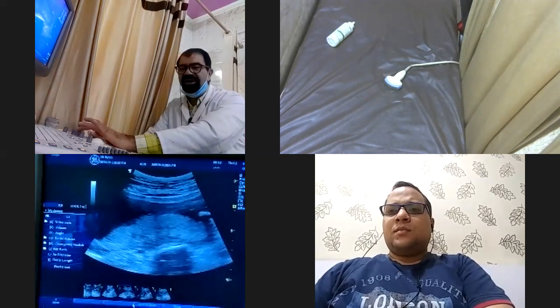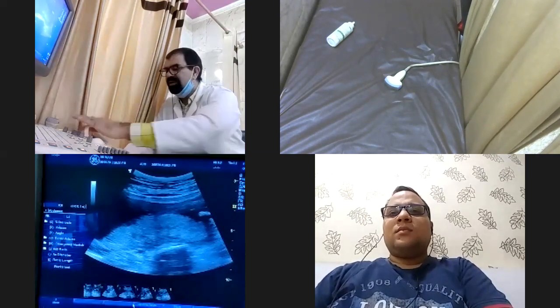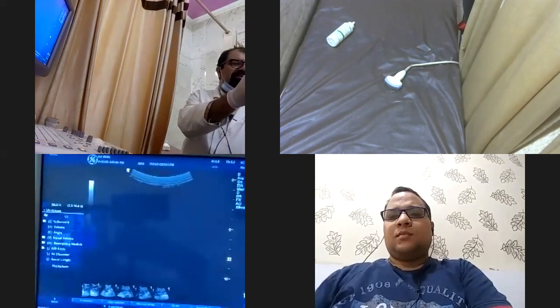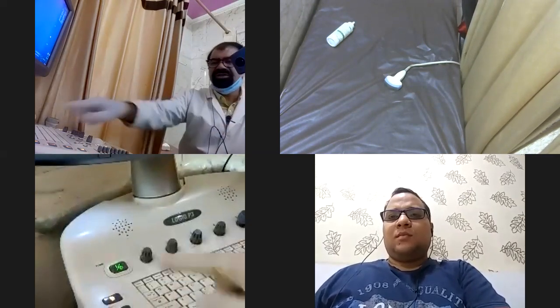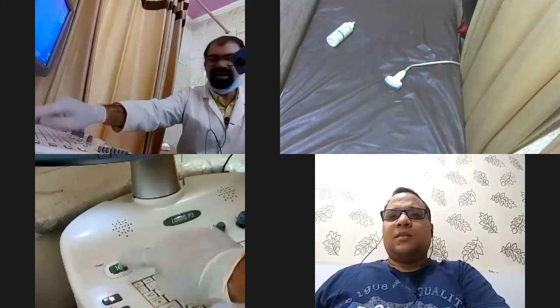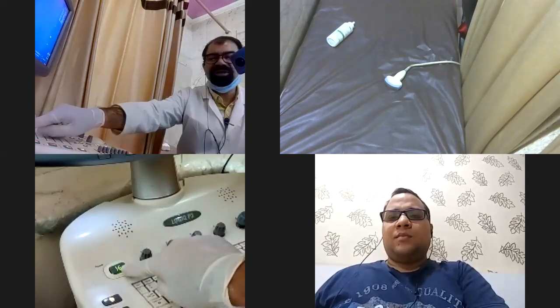We have already discussed it with you. I will show you the frequency over here. Wait, let me go to the machine. See, this is the machine over here. This is the on and off button, right? When I am starting, I press this and the machine is booting.